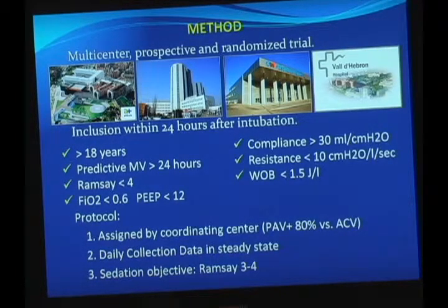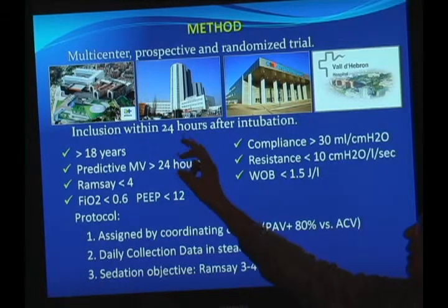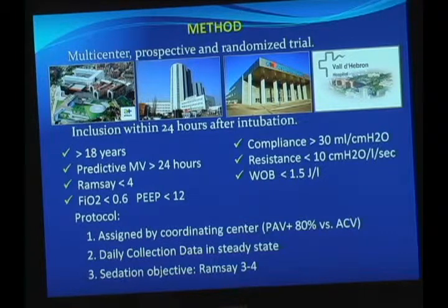The study was done in 4 different centers in our region around Barcelona, and some of the important points to understand the difficulty of enrollment were that we used patients in the first 24 hours after intubation, but for sure not expected to be extubated the next day, because if not, there is no sense in that.